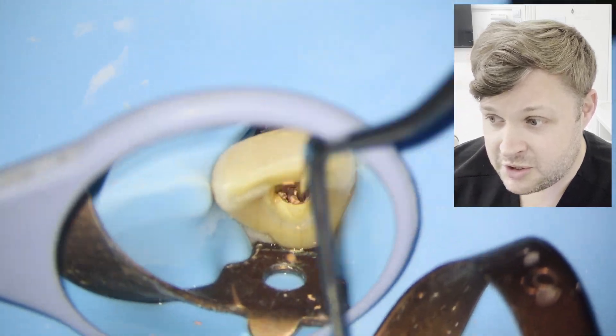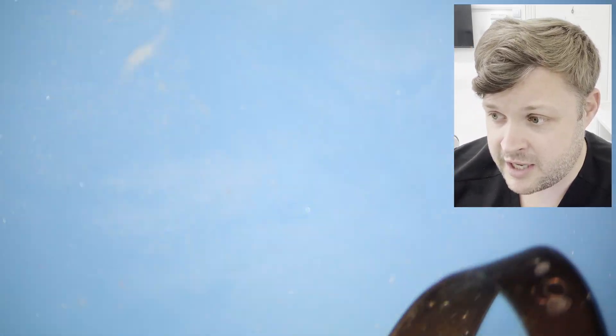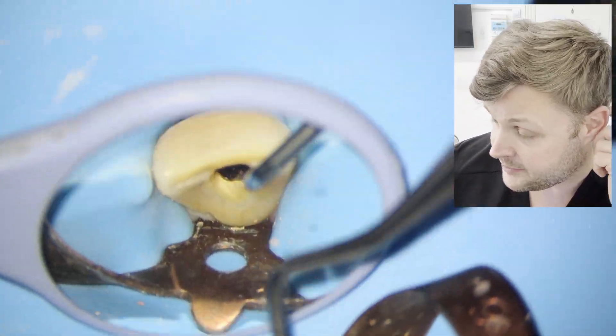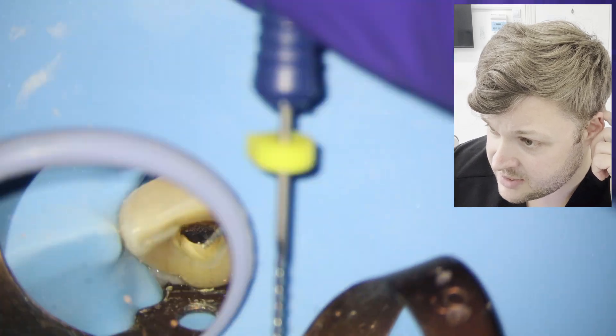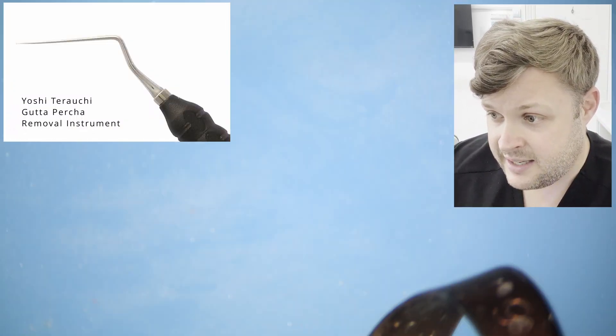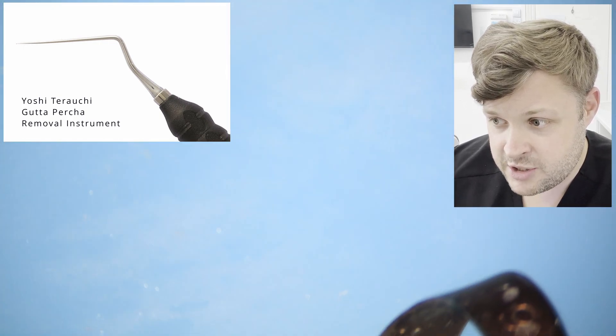Just be very patient, lots of irrigation, lots of H files. I'm also using a GP remover — I can never pronounce his name so I'll just flash it up on the screen. It's like a DG endodontic probe but on the end is a tiny little hook that can be used to flick out little bits of GP.